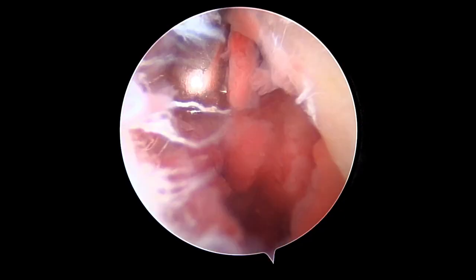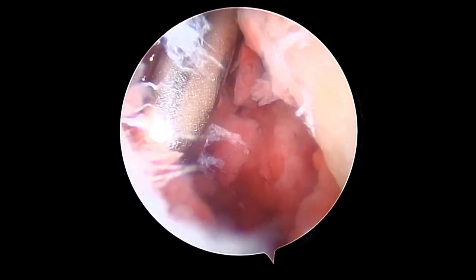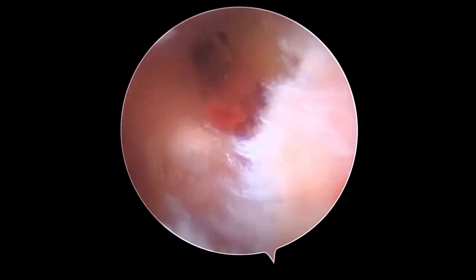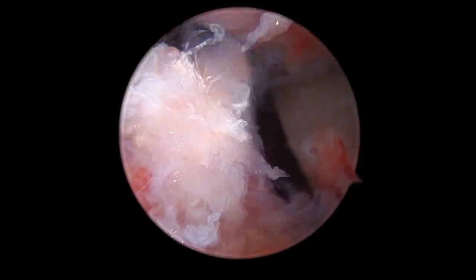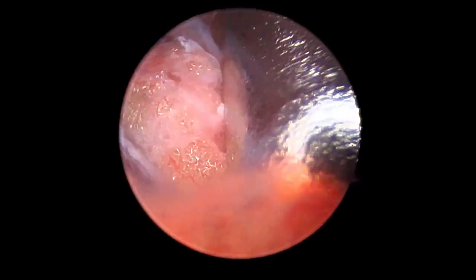Using the proximal posterior portal as the viewing portal, a hemostat is used to bluntly create the surgical plane. An arthroscopic shaver is used to clear the soft tissue covering the fracture end. Care should be taken not to damage the overlying skin by facing the shaver end away from the skin. Overlying periosteum can be cut open with arthroscopic scissors, and further debridement of hematoma and soft tissue is performed. The fracture gap can be entered afterwards.